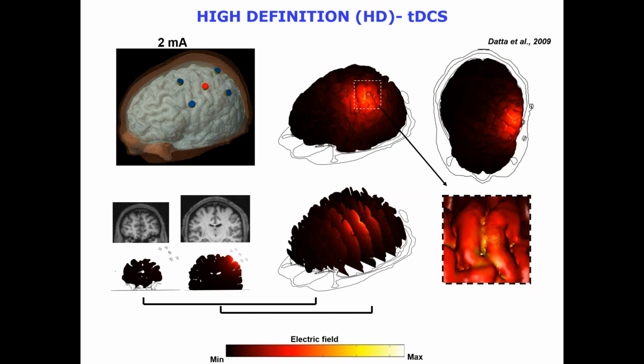The brain, as you see, will change quite notably, but those changes will fade out. Not from neurofeedback, because that's learning based, but the changes that you made on top of that, in this case with tDCS, will fade out in an hour or 2 or 3 or 4. But if you do it repetitiously over the course of a week or 2, you can get those changes in that network to hang, to resonate for a couple of weeks. So in our model, they'll do 8 to 10 treatments. We call that a round, the first round of treatment.